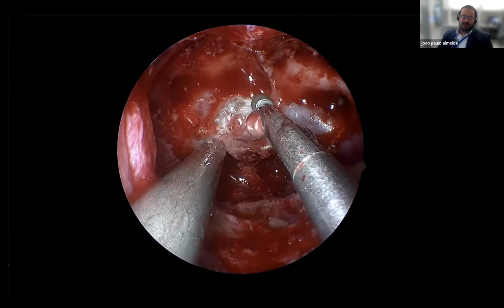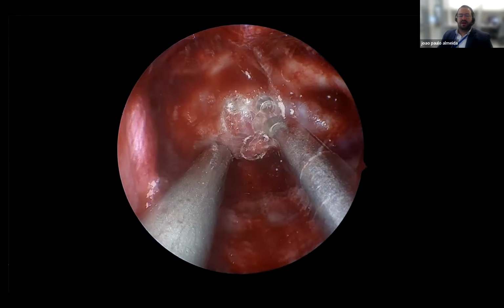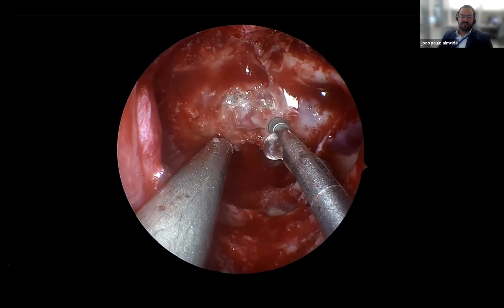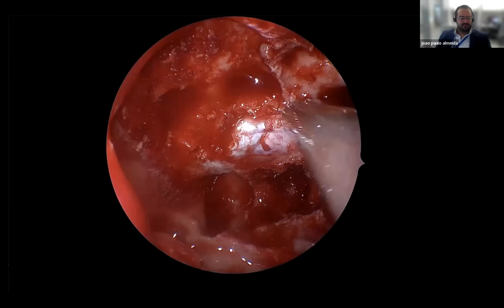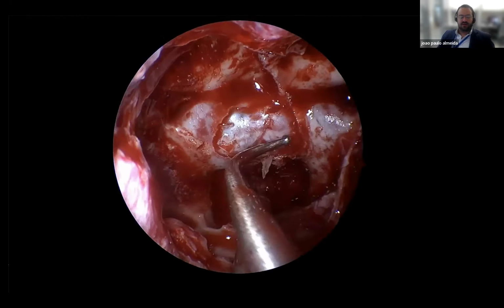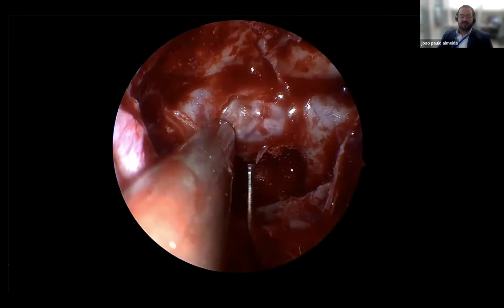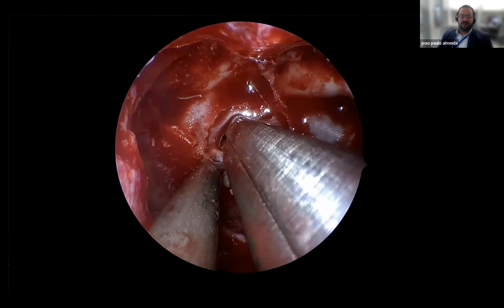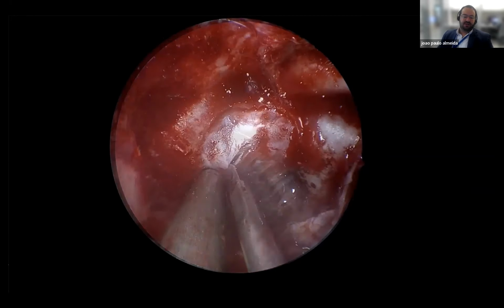of the sella. And after doing that, we can use a Kerrison to mobilize that anterior wall of the sella. And I particularly like to drill quite a lot to be able to mobilize that space. And here we're gonna get that piece of bone mobilized to work with that. And then we're gonna expand towards the right side.